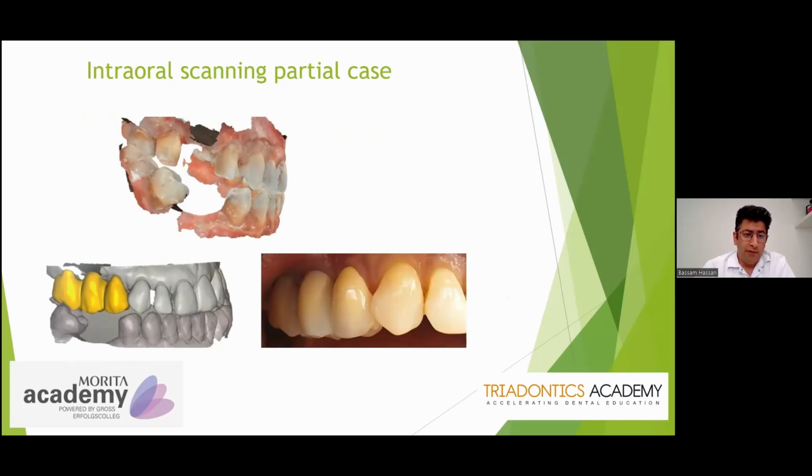And if you consider a scan like the one I am showing here, this is one of the first true color scanners that we had, in 2018. I remember at the time, they told me that you cannot really scan movable gingiva. So anything that moved, any free mucosa, or all those extractions done by surgeons, where they suture part of the cheek on the crest of the bone.